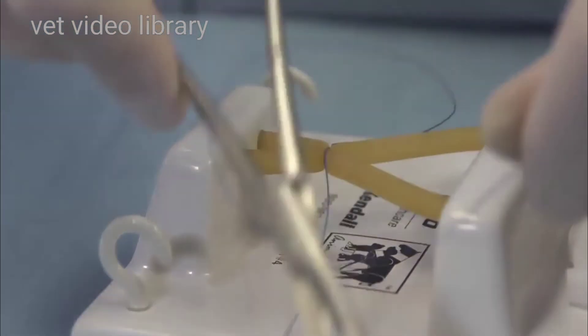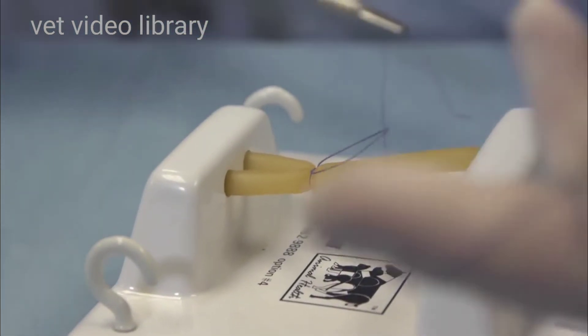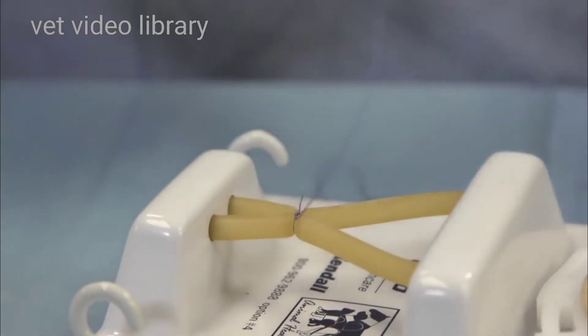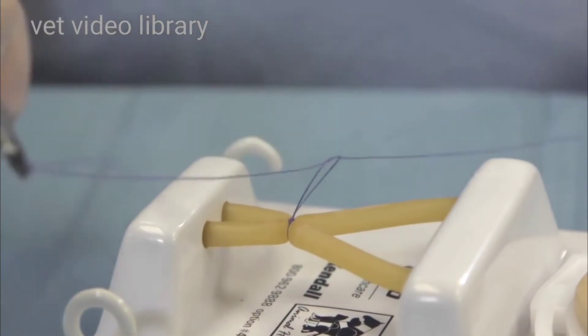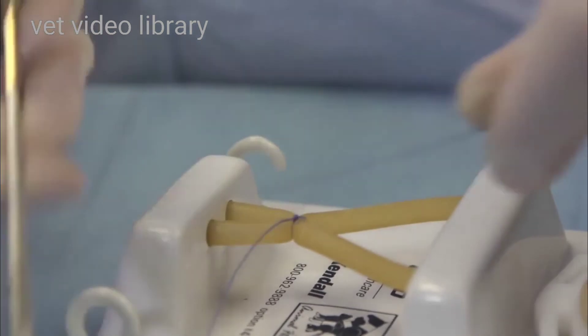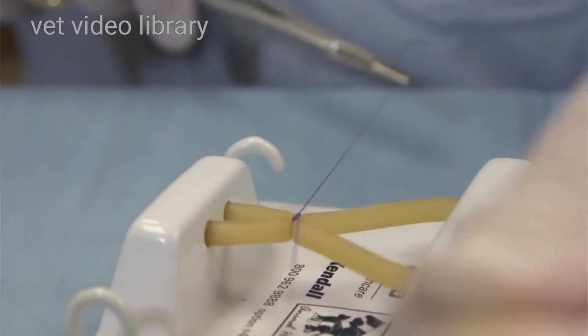And now I put a simple throw on top of that, and now that's a complete Miller's knot. On top of that, you can add simple square knots for added security.